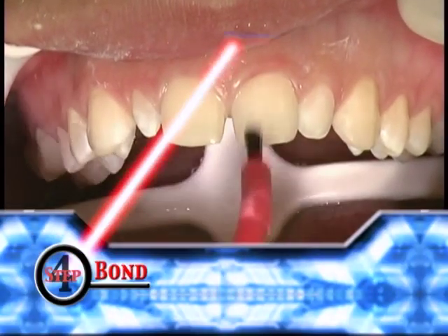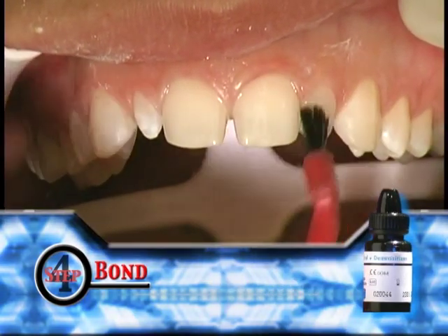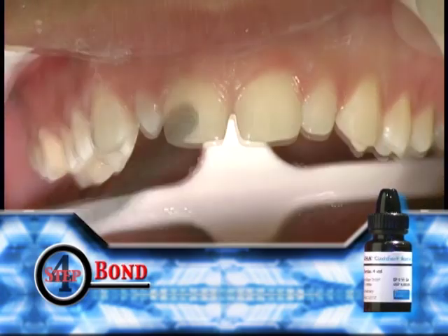Now apply the adhesive, Gluma Comfort Bond Plus Desensitizer. 3 consecutive coats should be applied. Wait for 20 seconds and then gently air dry. Follow by light curing.